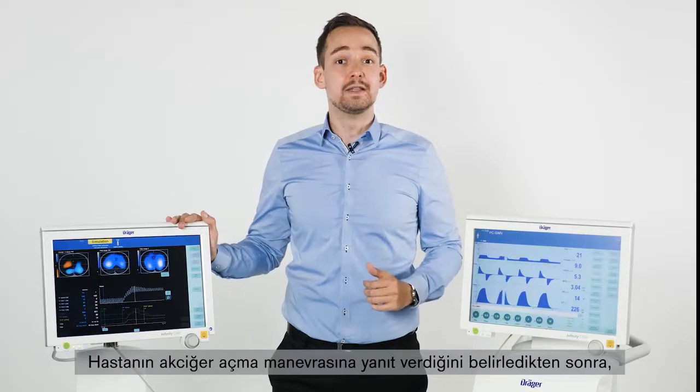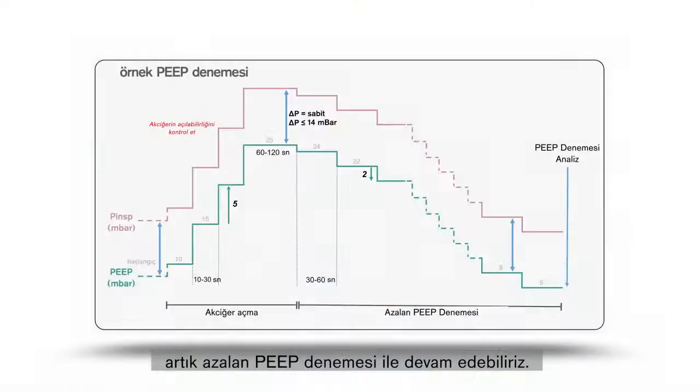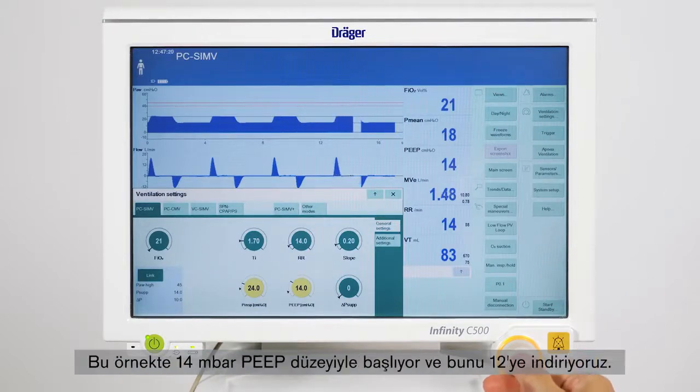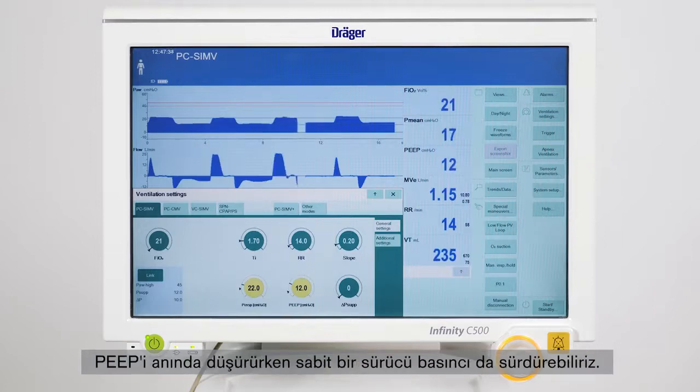Having identified that the patient is a responder to the recruitment maneuver, we can now continue with the decremental PEEP trial. For the decremental PEEP trial, we choose PEEP steps of 2 millibar and a constant driving pressure below 14 millibar. In this example, we start at a PEEP level of 14 millibar and lower to 12. Again, we can use PressureLink and QuickSet to lower the PEEP instantly while maintaining a constant driving pressure.